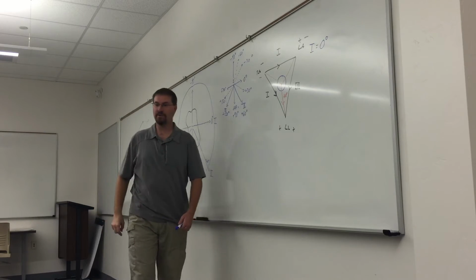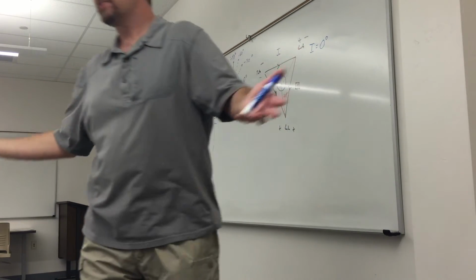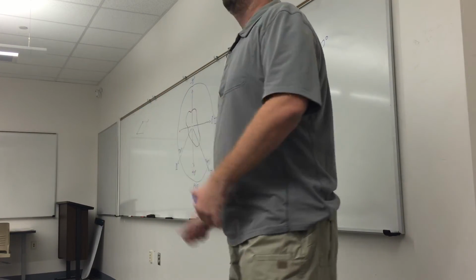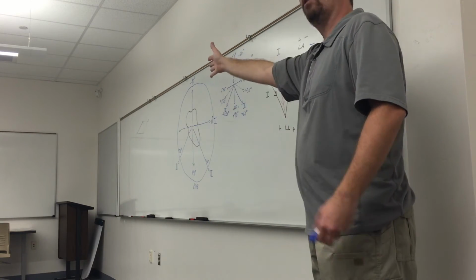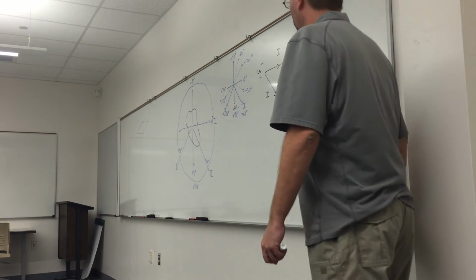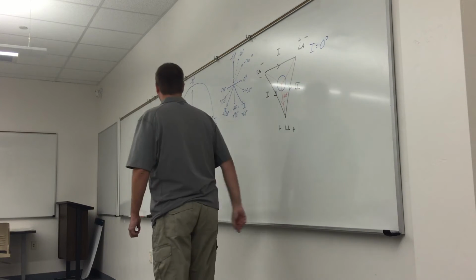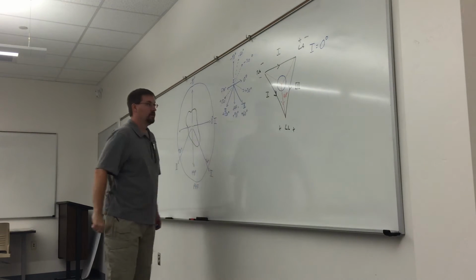And does it come as any surprise what lead we often do monitoring in? Lead 2. Does that come as any surprise, knowing what we know now? Not really. Lead 2 is a good lead because it generally looks right along the mean cardiac axis. You guys cool with that? So it's really good at finding ventricular dysrhythmias, which is what we do with rhythm strips. Okay, cool. So we've got our coordinate system here.